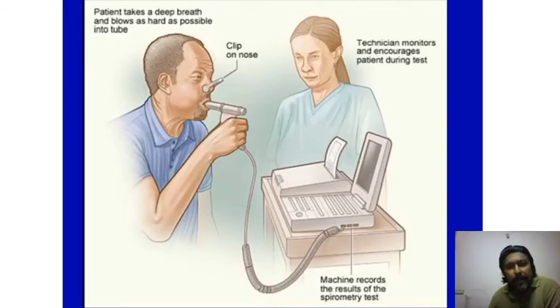Now this slide pictorially represents how a patient will undergo the spirometer test to check the efficacy of the lung functioning. I hope you notice there is a clip on the nose. We generally don't waste even the tiniest amount of the gas, right? That's the reason for the clip on the nose.